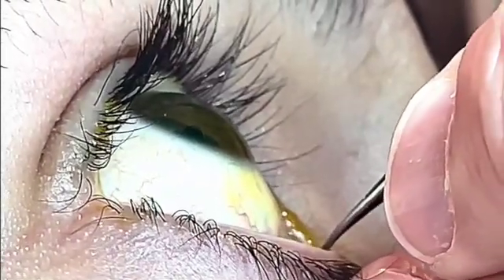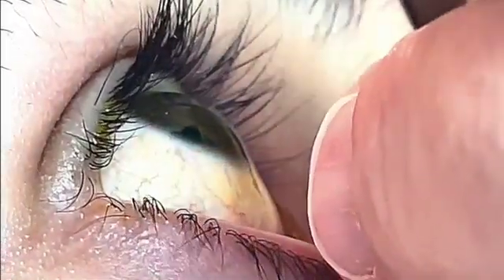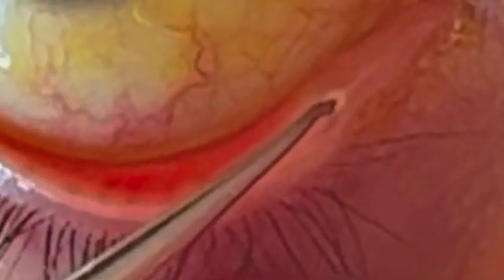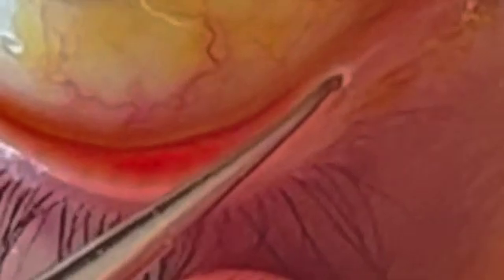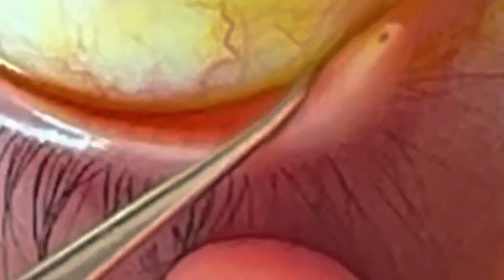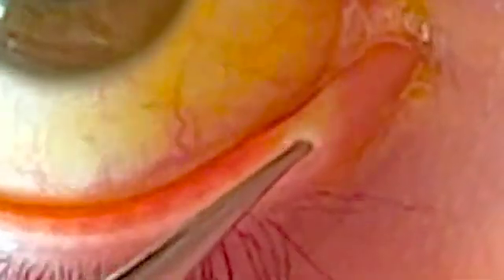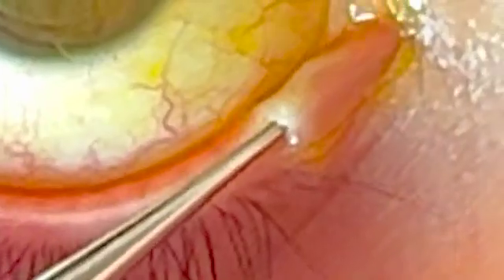Here the puncta is popped open. Listen. This is the second shot displaying the eye so you see what is done using the first metal tool, the punctal dilator. Listen. After the punctum is popped open, the punctal dilator is inserted into the punctum opening it made. It moves around inside the tiny opening to dilate the hole and increase the space for the plug.